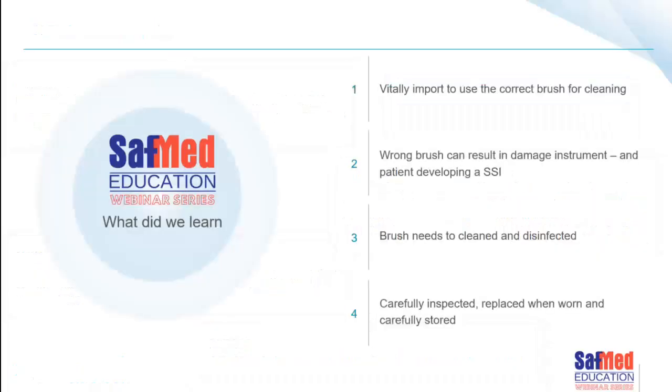Right, before we summarize what we've learned, I just want to have a look at the chat box to see if anything is coming over there. Thank you very much to everybody who has made some comments. Yes, if you've bought your brushes from reputable stores and you've looked at the instructions for use, please confirm the instructions for use. Yes, some of them can go through an automated washer disinfector cycle. We won't provide a copy of the session, but we are recording this, and we will post it on our YouTube channel, and in a week or so's time, we will send you the links.